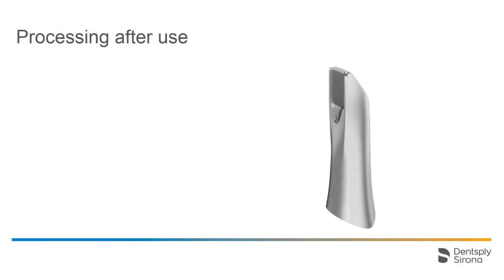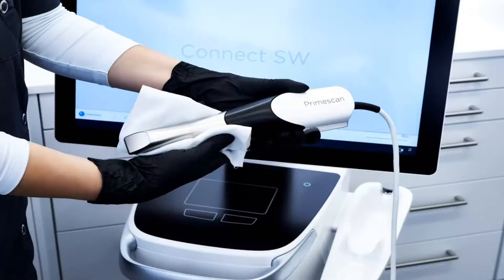Next, let's look at the steps after use inside a patient's mouth and the associated processing of the sleeve. First, perform a wipe disinfection of the acquisition center, including the scanner. For detailed information about this process, please refer to our video tutorial entitled Acquisition Center and PrimeScan – Cleaning and Disinfection Procedures.